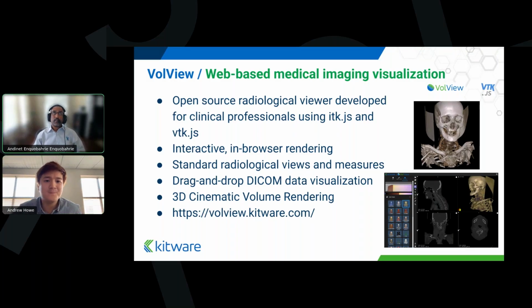In terms of HIPAA compliance, this involves a lot of conversation with the IT. There are a couple of things to bring up, right? One is if this web app system is hosted within a secured server, and then you have additional security controls. Obviously, you want to have credentials and authorizations, user access management on top of VolView.